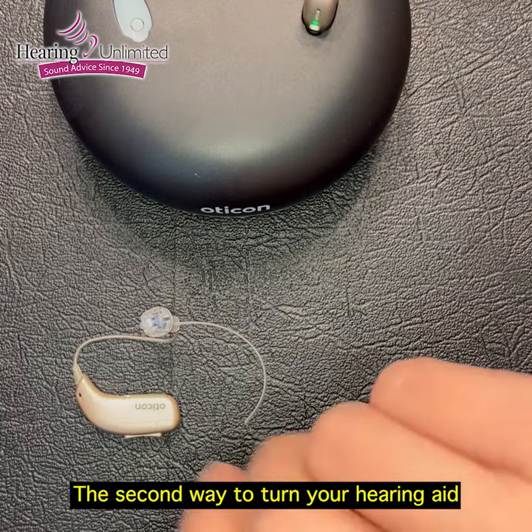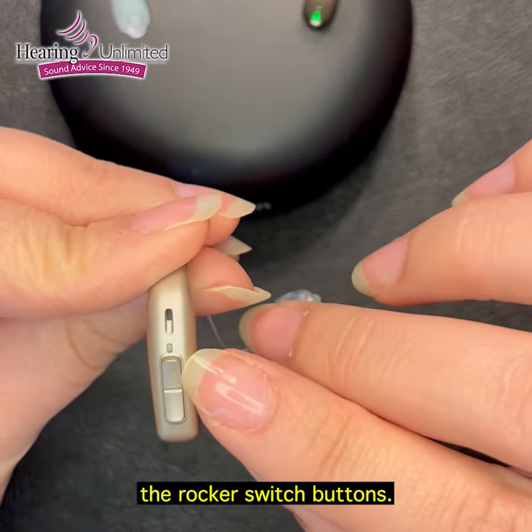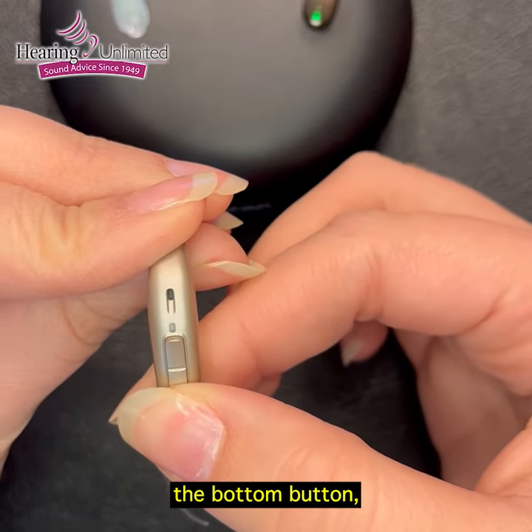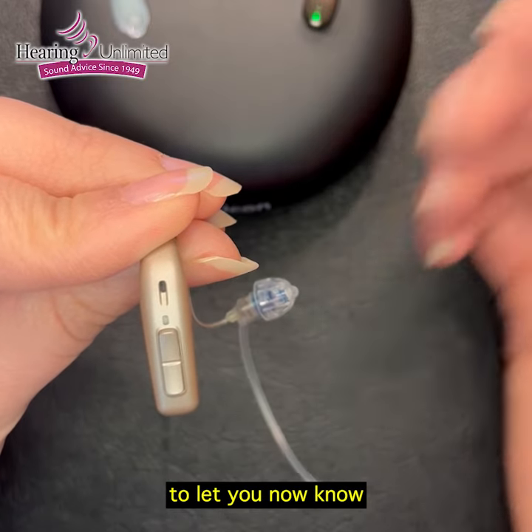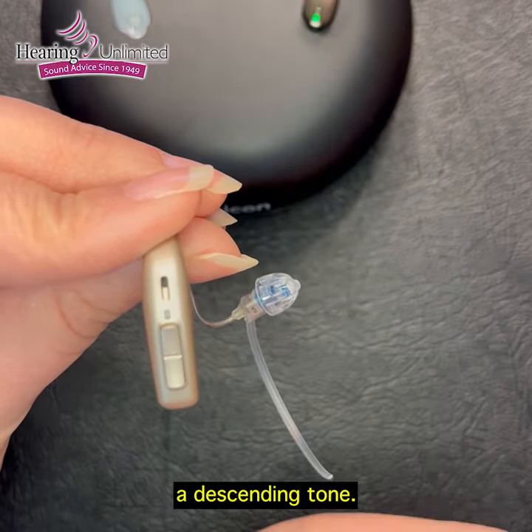The second way to turn your hearing aid on and off is by using the rocker switch buttons. If you press and hold the bottom button, an orange light will appear to let you know that the hearing aid is turned off. It also makes a descending tone.